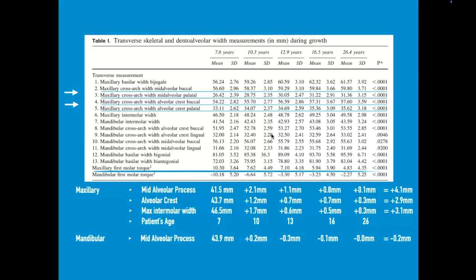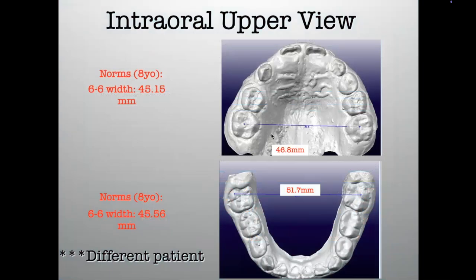Because the more we expand, the more we have to compensate or decompensate back the lower teeth to get the teeth to fit afterwards. So we're going to get as much as we can, as much as the patient can tolerate with an initial expander.